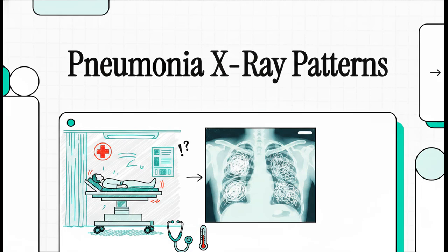Picture this. You're in a completely slammed emergency department. A patient rolls in with a spiking fever, a nasty cough, and they're really struggling to breathe. Right away, the first diagnostic tool you're probably reaching for is the chest x-ray. It's an absolutely indispensable frontline tool for us.